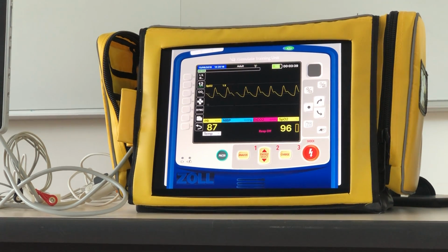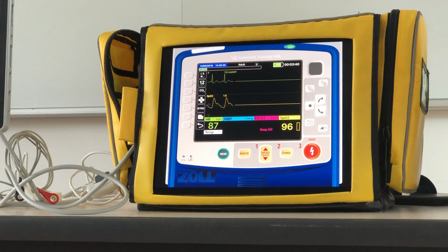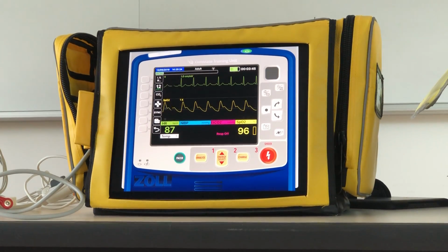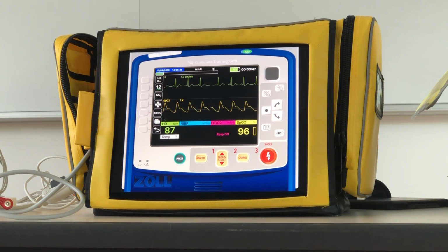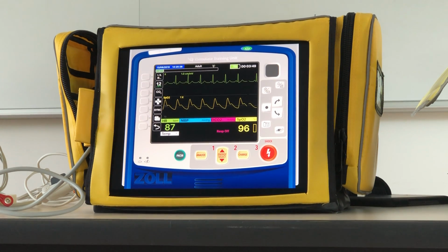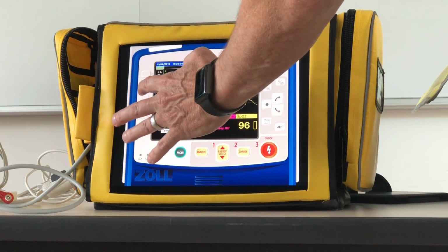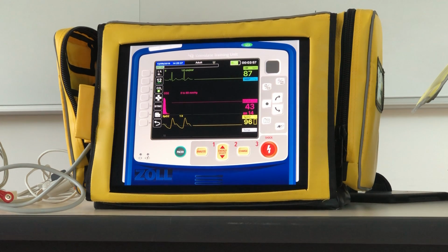Once they hook that up to the patient, you just hit the eyeball, and now they're going to see their ECG tracing. Okay? Same with your capnography. They have to hook up, and on a LIFEPAK, you turn on the capnography, they see it. On a Zoll, you put on the capnography, you have to tell it you actually want to watch it, and then it'll come on.